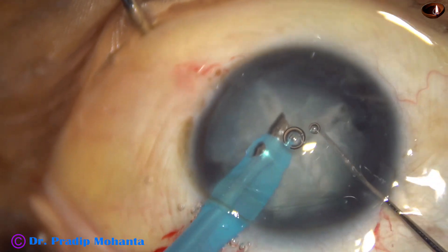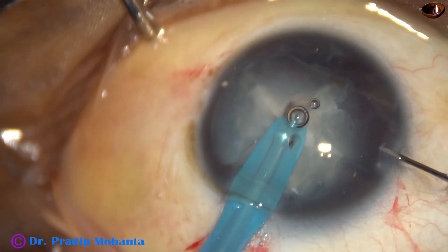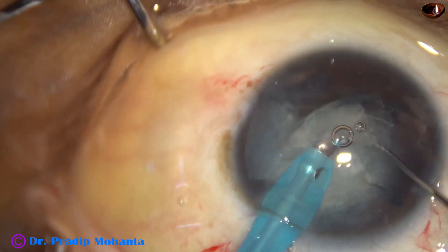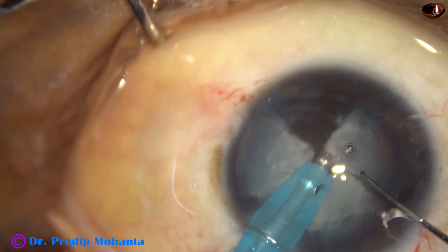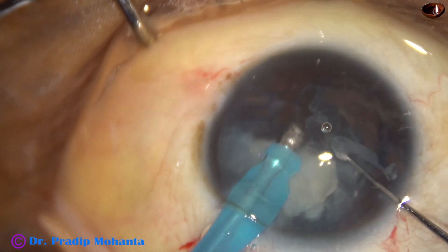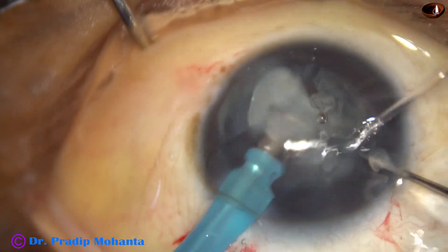So, I could divide the nucleus into several pieces. In this case, let us discuss the settings. From the beginning, I am using low vacuum and low flow rate. Bottle height, which is usually 101 centimeters in my surgeries, has been reduced to 76 centimeters. Flow rate is 30 and vacuum is 300 mmHg. So, with low vacuum and low flow rate, I am managing this nucleus.